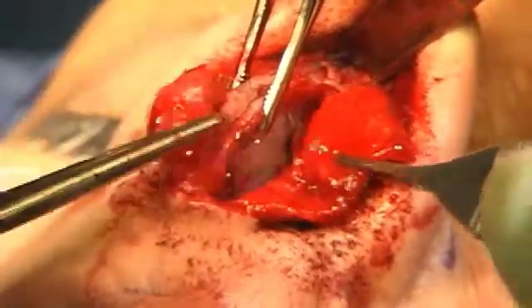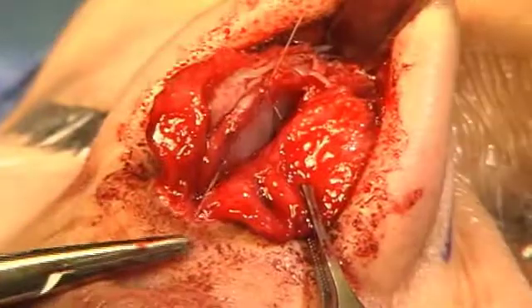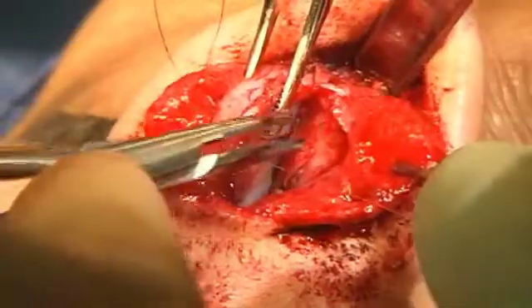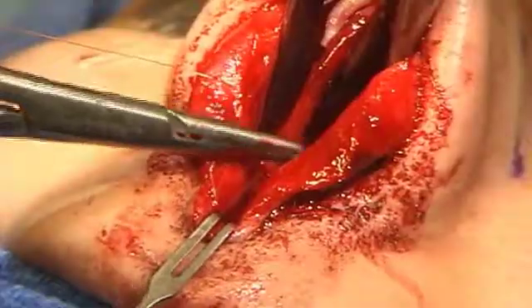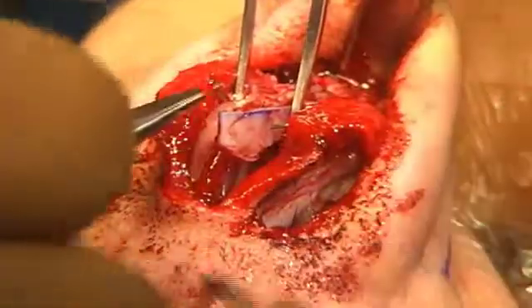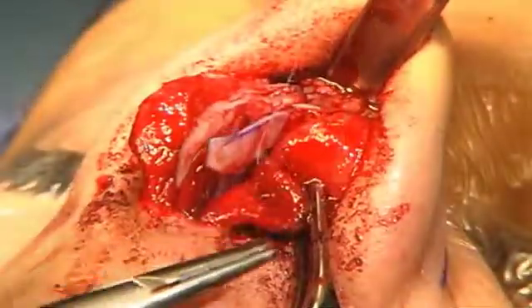It was deemed appropriate, since it was relatively straight, to simply be placed as an end-to-end graft. This was placed with several interrupted 5-0 PDS horizontal mattress sutures and stabilized end-to-end and fixated side-to-side with the splinting graft. It was then stabilized through a transverse drill hole at the base of the nasal spine with a 5-0 clear nylon suture, and stabilized on the opposite side along the dorsal component with the opposite spreader graft.